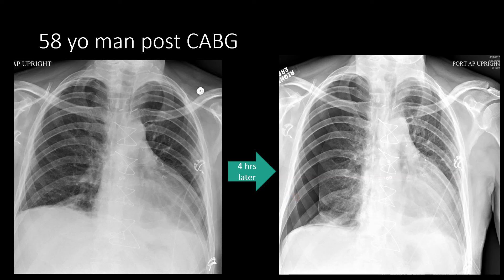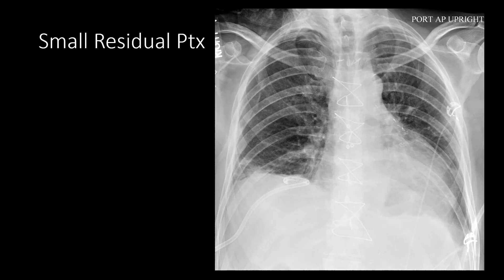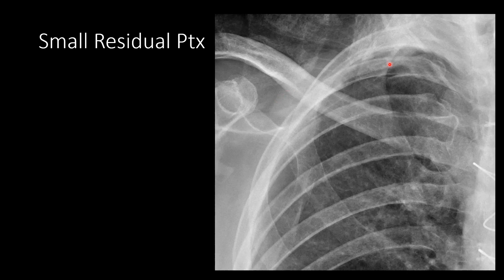In this case, a chest tube was indicated, and a pigtail catheter was placed in the lower right hemithorax. We see a small residual pneumothorax in the right apex, but that is something that we can manage conservatively. Zooming in just to show that subtle small pneumothorax in that right apex.